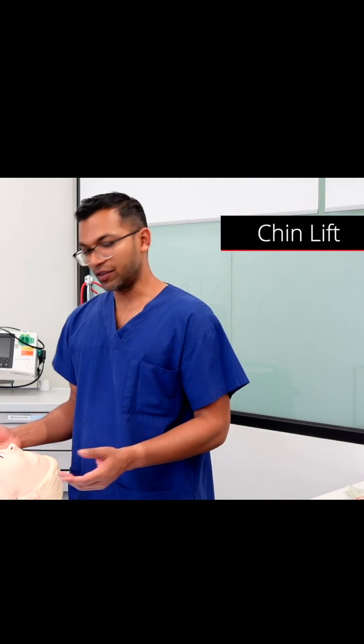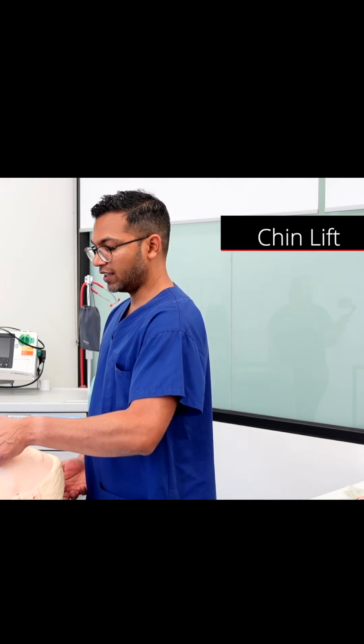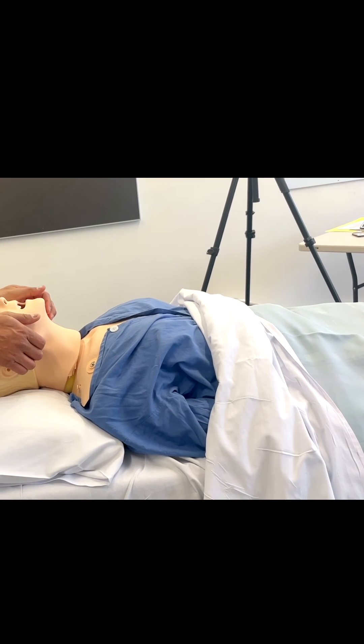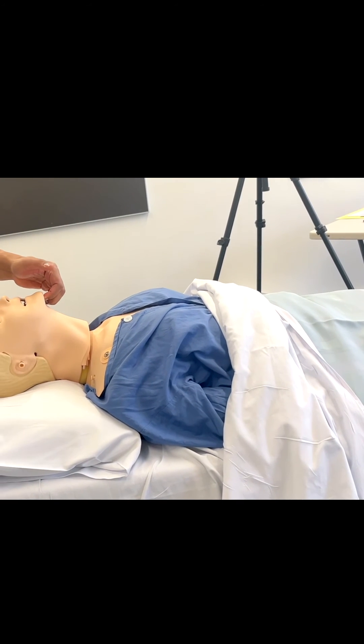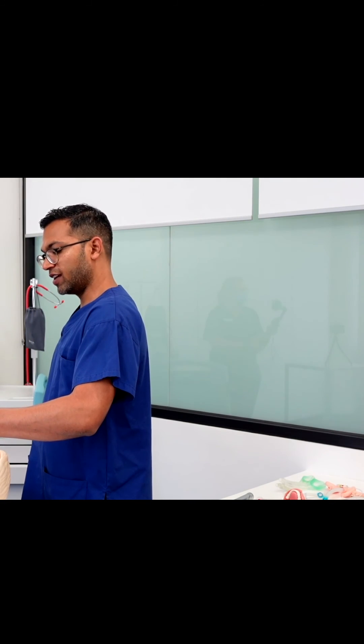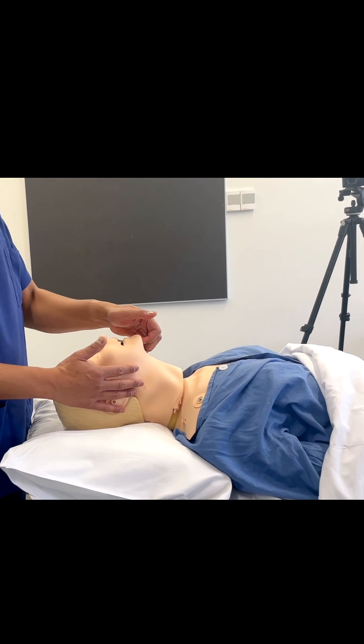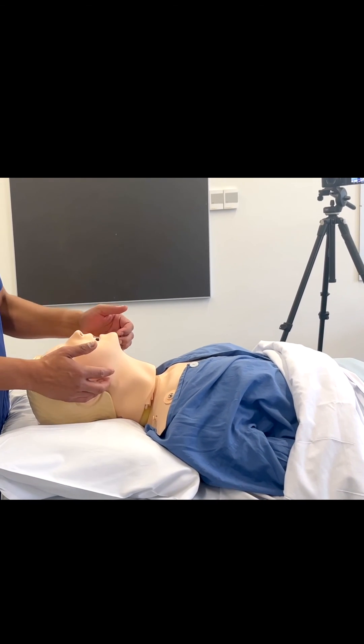The final maneuver is the chin lift. This is putting your fingers just at the chin or the mental prominence and then lifting up. It works as a combination — when you do a jaw thrust, you can often then hold the jaw thrust in place with a chin lift. This more active approach makes holding that chin position much easier. It does take a lot of strength, especially in a mannequin like this, and in some patients as well it can take a lot of effort.